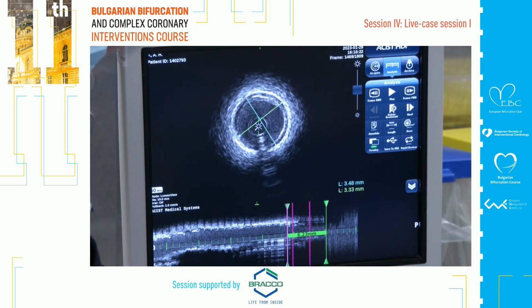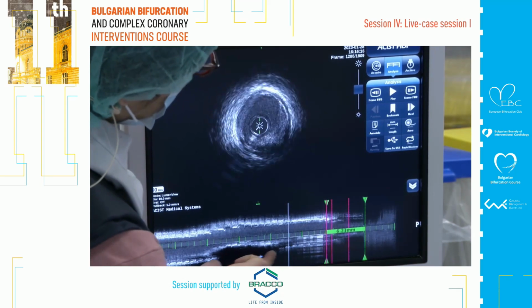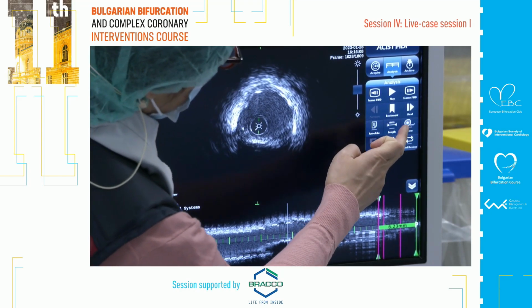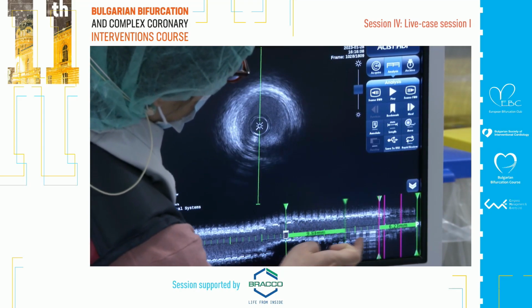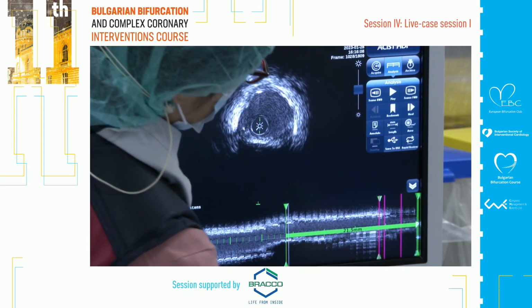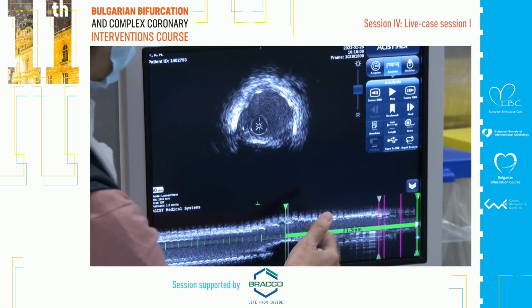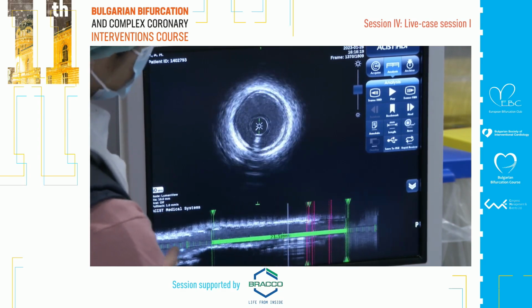Stent. Because there is an old stent, we can overlap the stents. Oh, no, you don't have to. If you go to the stent to overlap, it's going to be okay. So this is the old stent segment. If you cover everything up to the ostium, it's going to be like 22 or 23. And in between is not much disease. I don't think you have to.